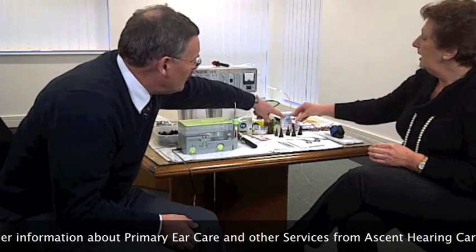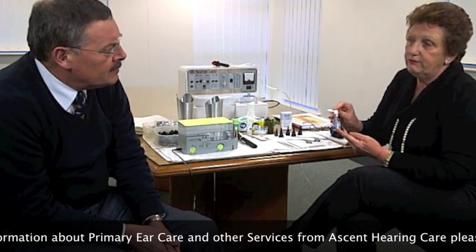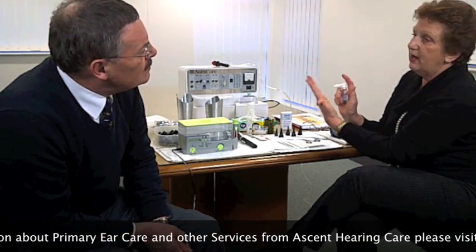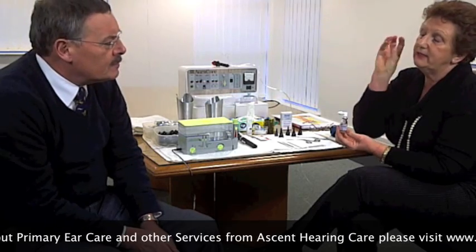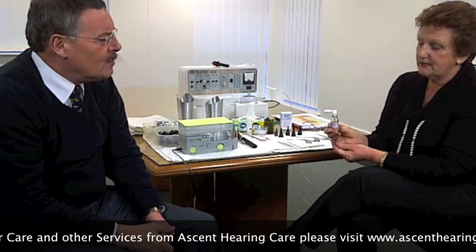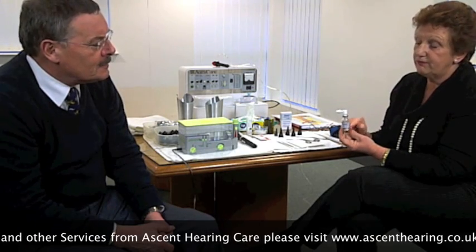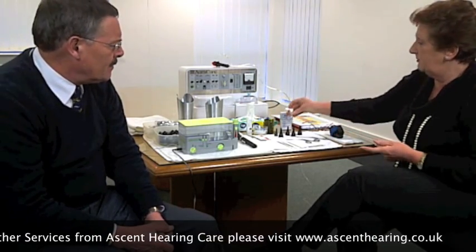And what's this here, Victoria? This is ear oil — very useful. It's an olive oil liquid in a metered spray, and that spray will actually coat the whole of the ear canal and help to soften wax. It's a measured dose — because a lot of the time with droppers it all runs down, but you don't get that problem with this. And you can buy this on the High Street from any Ascent Hearing Centre, where they have it as an over-the-counter product.